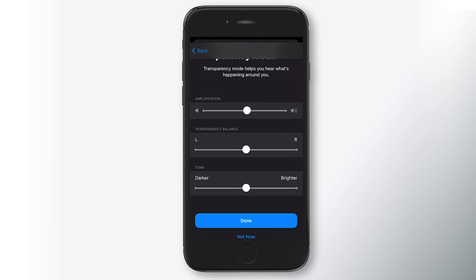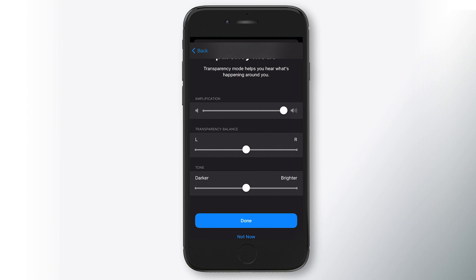If I turn that to its standard setting right there, that's going to be a comfortable level for most people. But if you're used to wearing hearing aids, you're probably going to crank that thing all the way up. And just as a note, based on testing, it seems that the AirPods are naturally darker in their tones because a lot of people are sensitive to higher pitch noises. So you may actually come down here and adjust that brighter and it may sound more natural to you if you're used to wearing hearing aids. If you've not worn hearing aids, it'll actually sound probably more natural to be around middle or maybe just a little bit darker. And you can always come back in here and adjust it and make it brighter as you get used to them. So we're going to take that back to about right there is where I'm comfortable, where I like it personally.